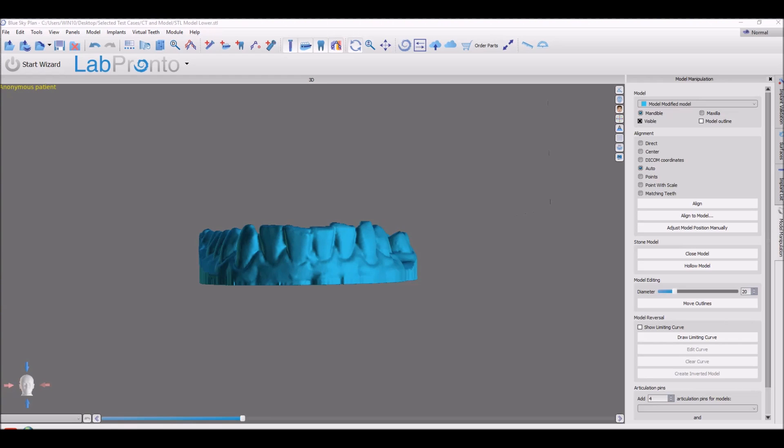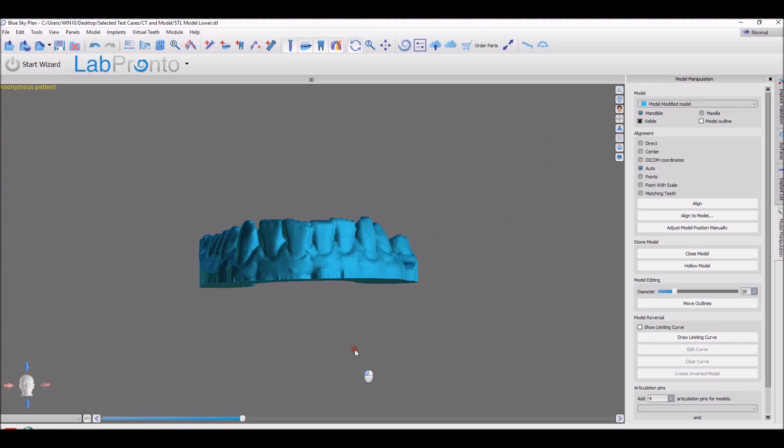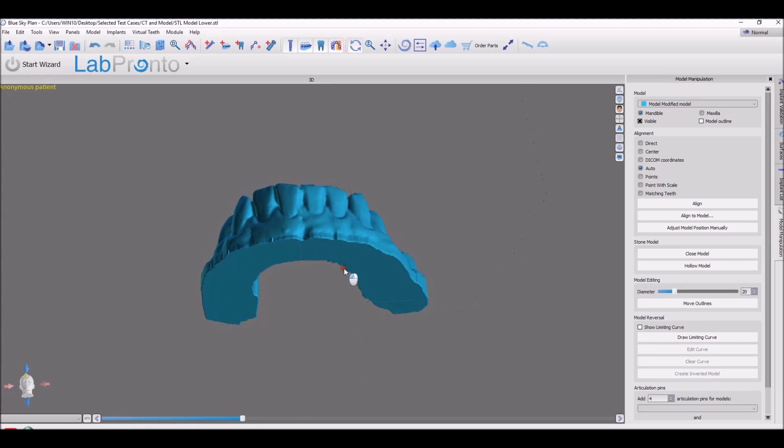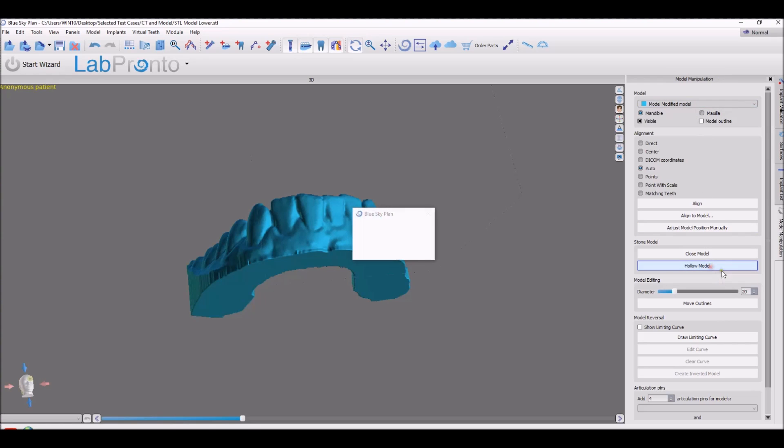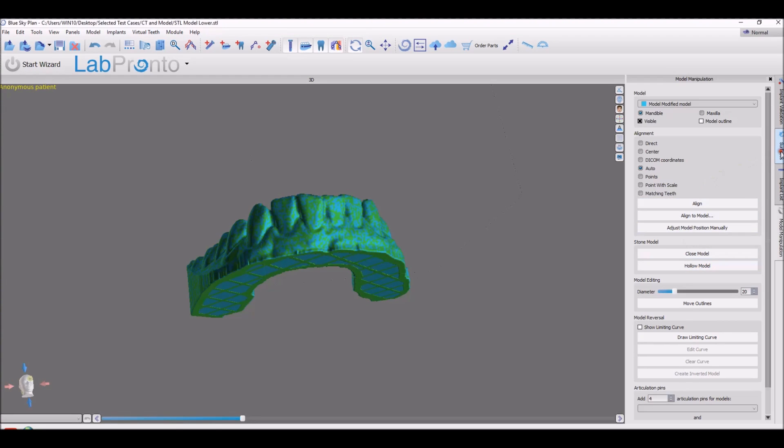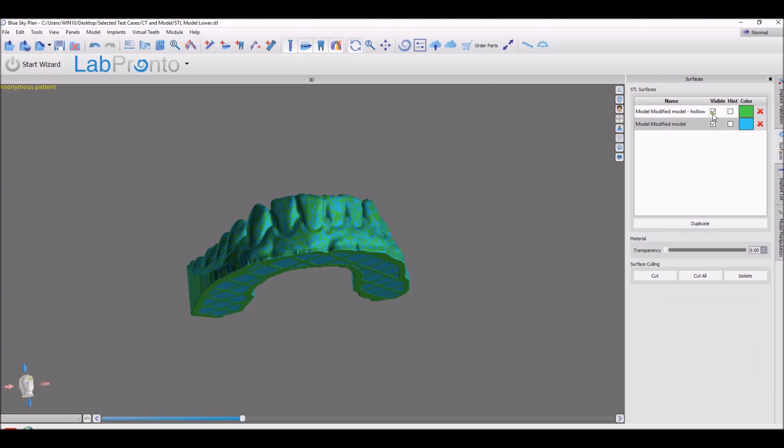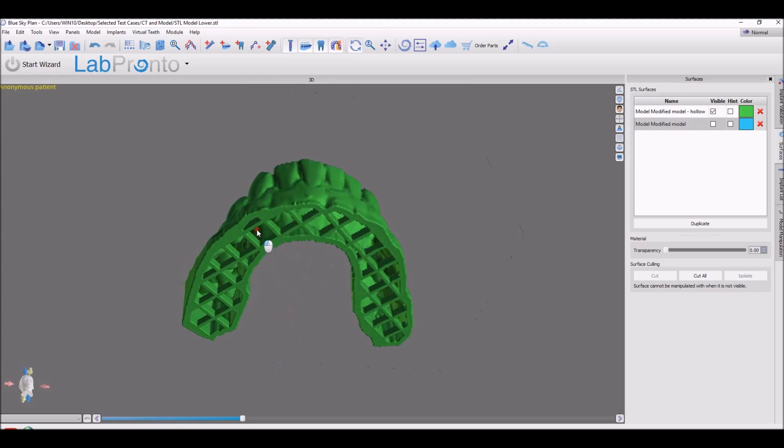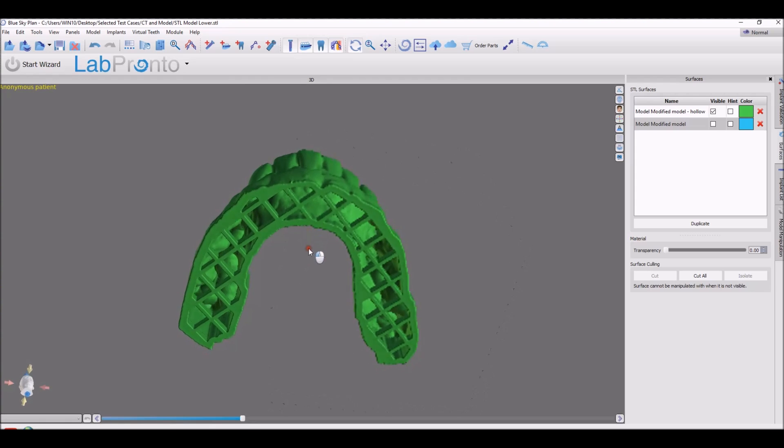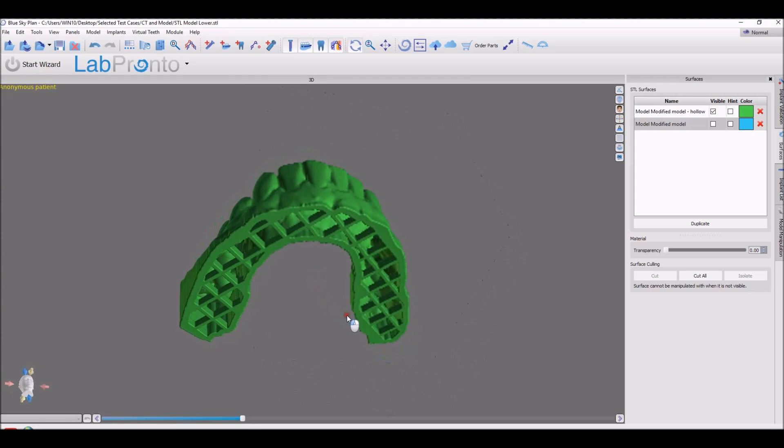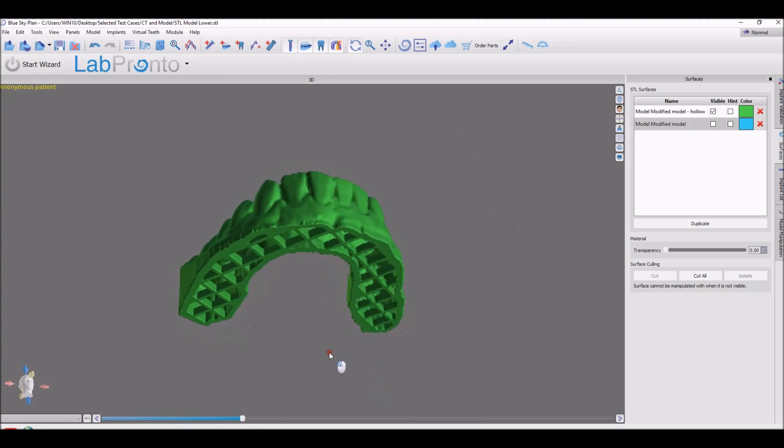We've added the ability to create a hollow model, and that can be done in the model manipulation panel by selecting the correct model and clicking Hollow Model. This creates a new surface that is now hollow, resulting in a faster printing time with less material.